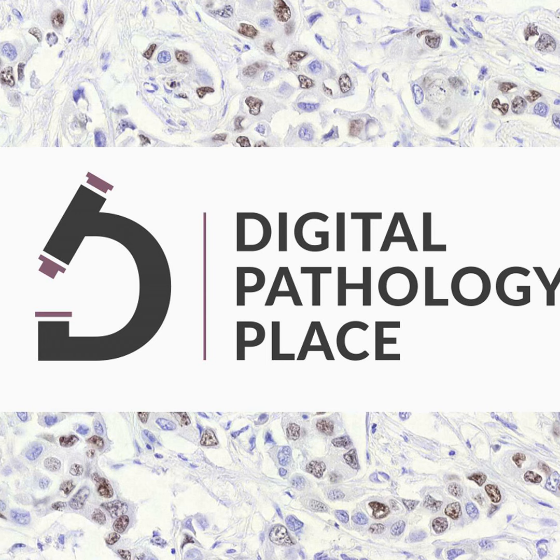And why the convolutional neural network? I think it's the competition wins. There were a couple of independent cases, one German group that did mitosis counting in 2012 with convolutional networks, and ImageNet. So at the same time, the invention of the convolutional deep neural network was the reason. Also, creating practical tools so that it can be taught with GPUs, because you need a lot of computational power to teach convolutional neural networks.